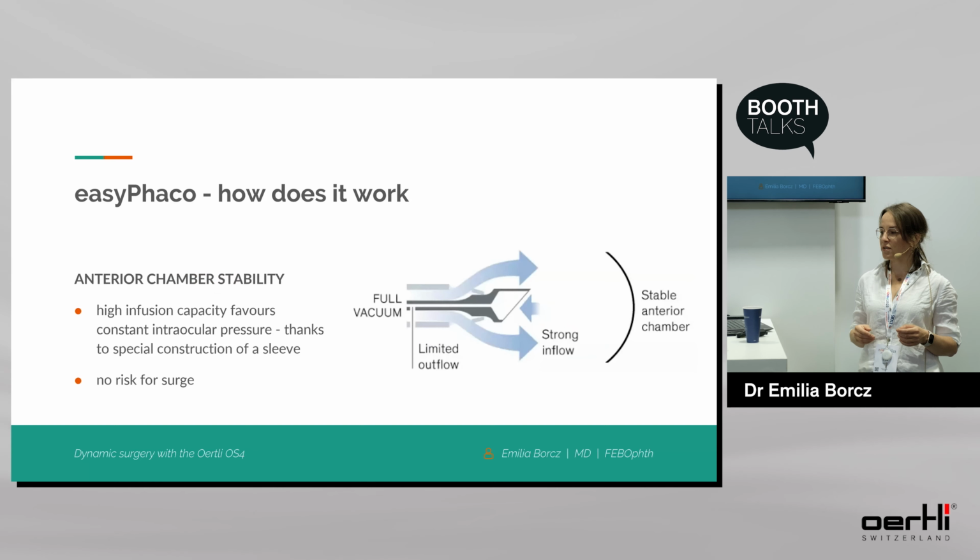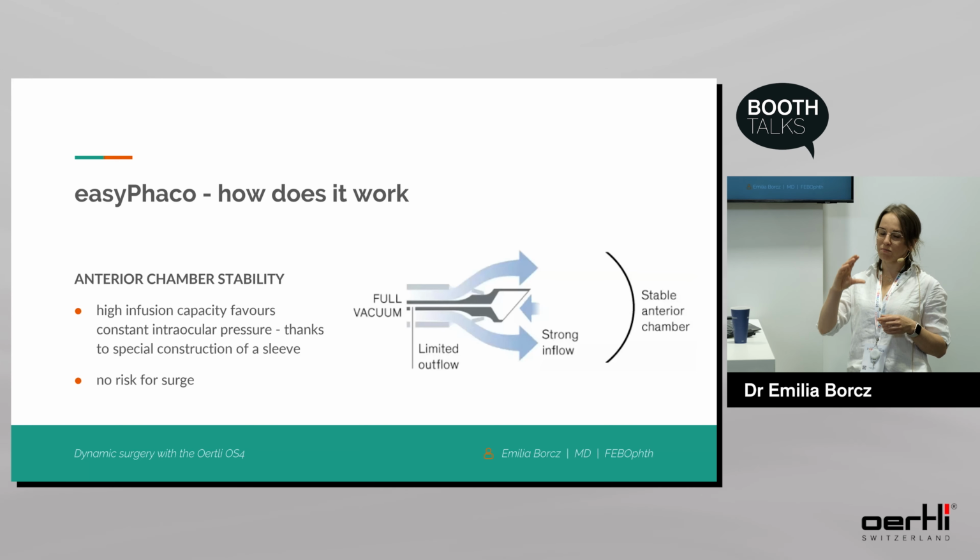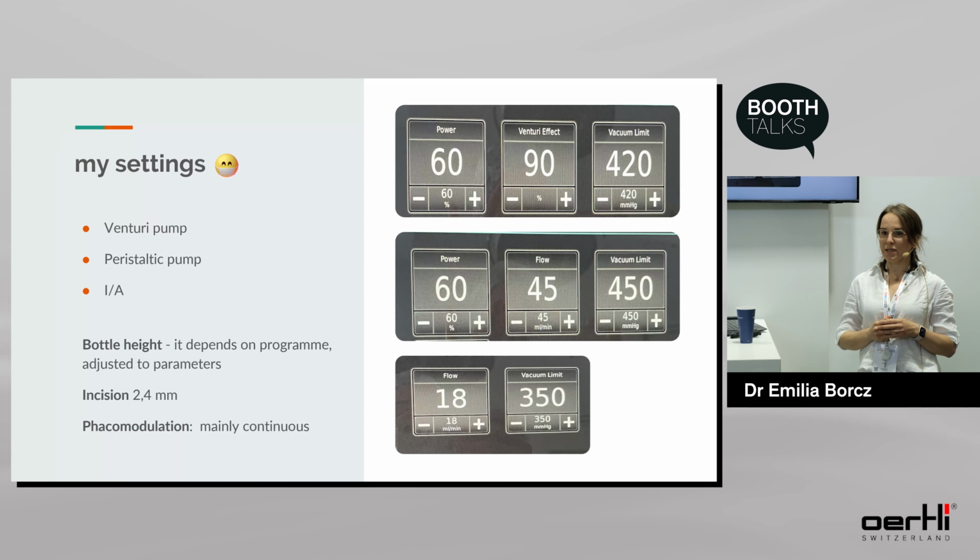And also easyPhaco gives us very nice anterior chamber stability. There is no risk of surge thanks to the special construction of the metal tip and also of the sleeve. A few words about my settings that I use. I use only one program for lens removal, and after that IA setting. I used to use peristaltic pump with 45 flow and 450 vacuum, but right now I'm a big fan of Venturi pump with 420 vacuum.